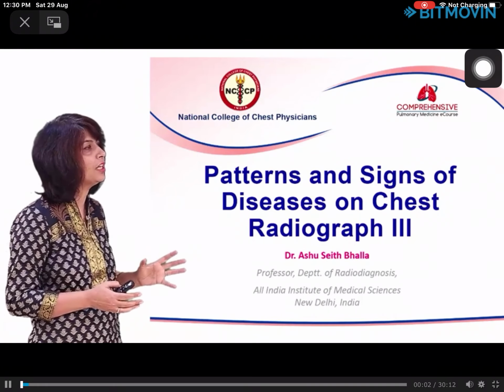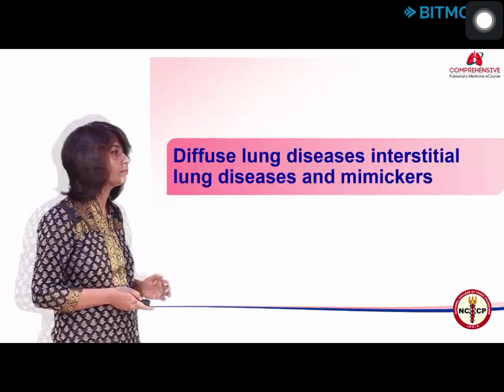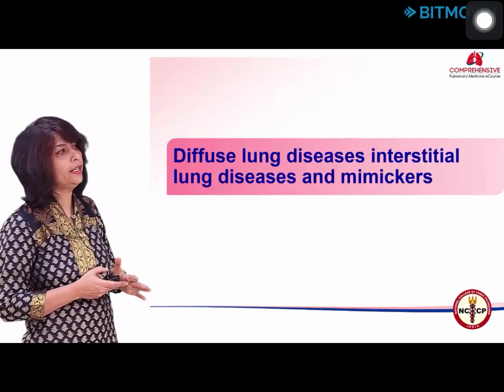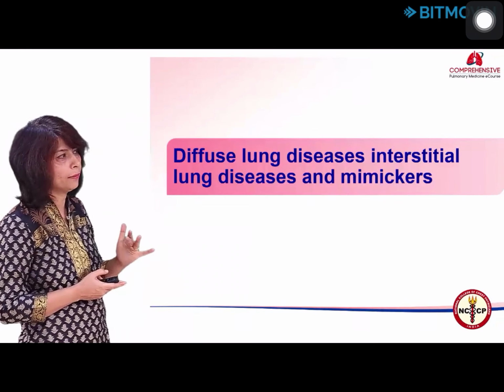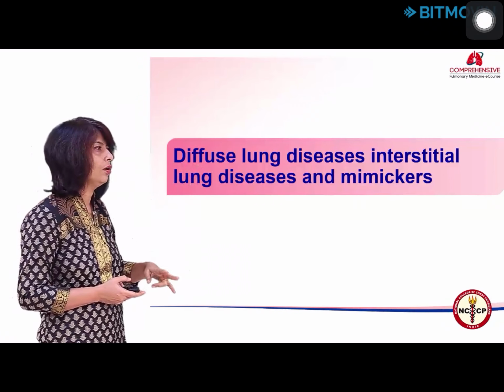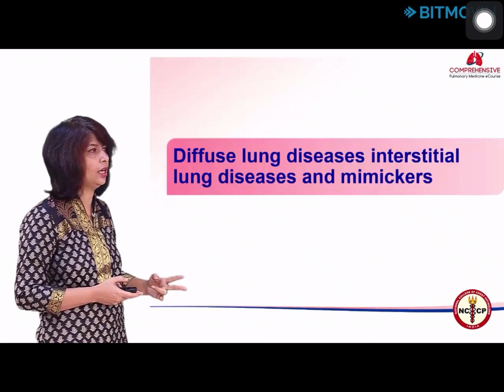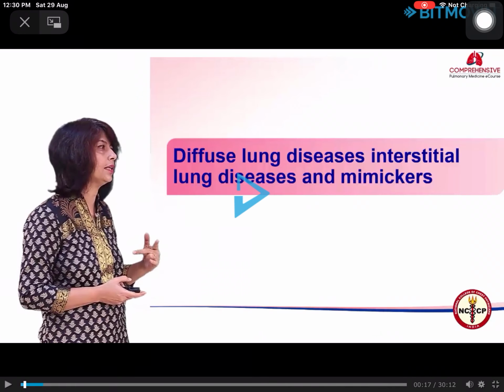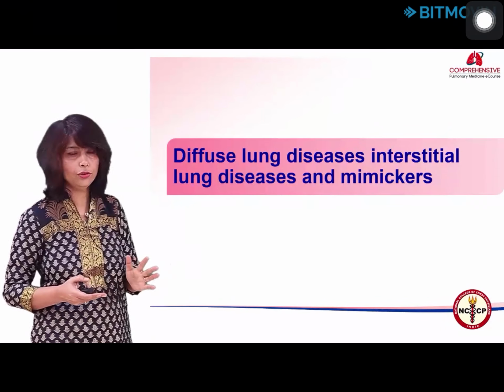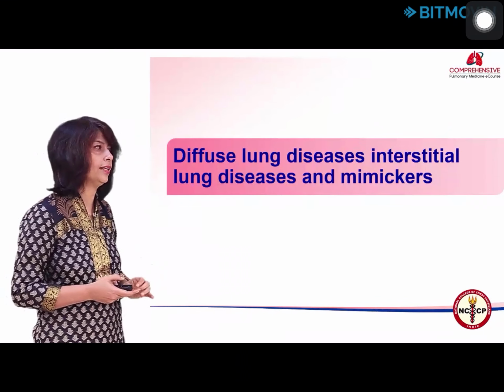Third part, which will be covering the following lesions. Now that we are not talking of ILDs as such, we are talking pattern approach, but I would just like to address this issue of when to use the term interstitial lung diseases and to use the term diffuse lung diseases. You're welcome to use either of the two terms, they are both acceptable.